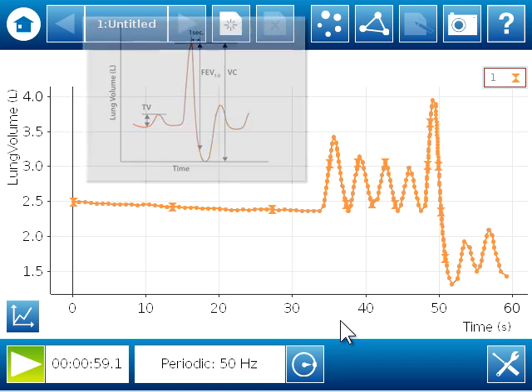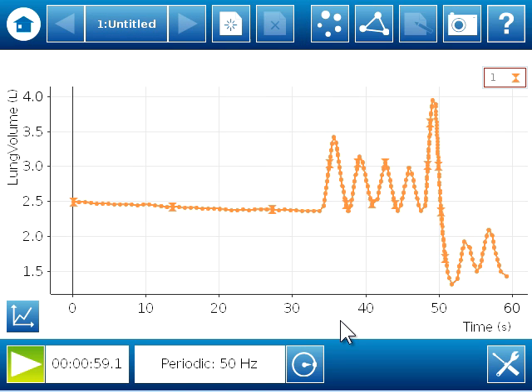In part 2 of this series, we'll go ahead and take a little more time to analyze this data, but now you've seen how to set up your spirometer with the calculation for volume and how to begin data collection.